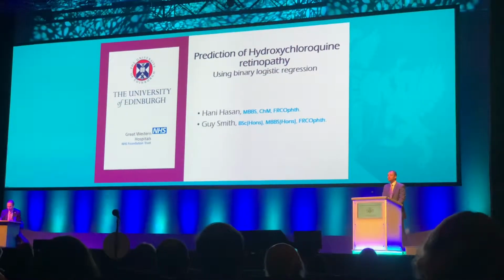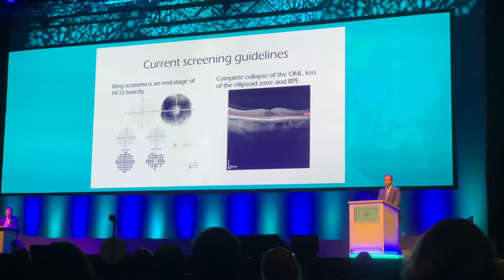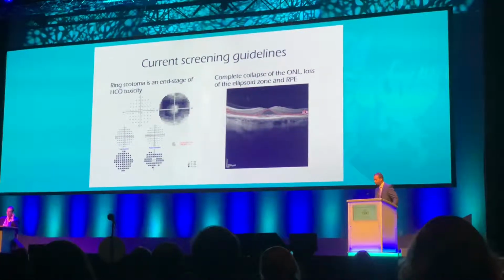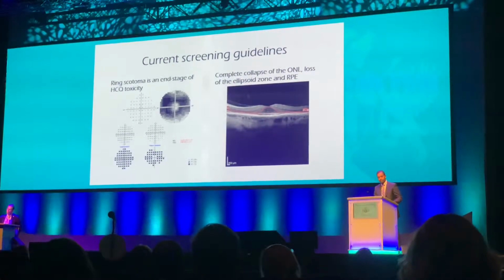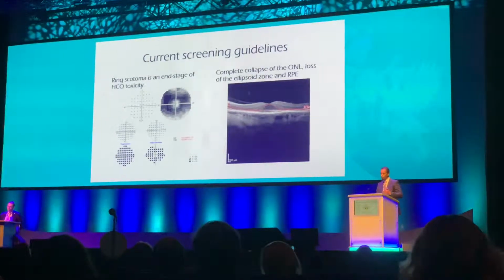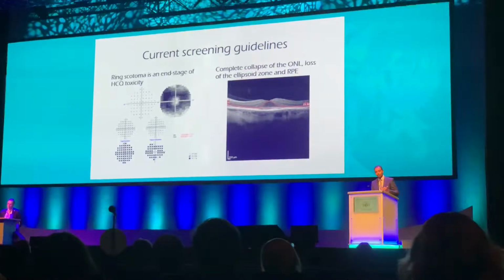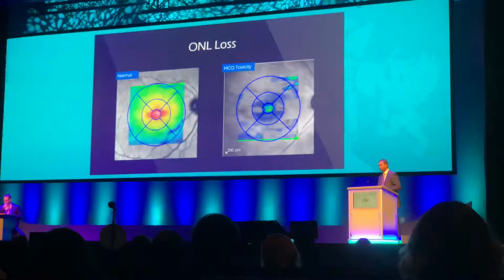Good afternoon. Screening for hydroxychloroquine retinopathy is done using the visual field test 10-2 and the OCT scan of the macula. Interpretation of these tests can be subjective and can lead to interpersonal variations. We therefore aim to produce an objective way by which we can diagnose, monitor, and predict hydroxychloroquine retinopathy.